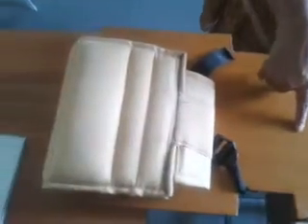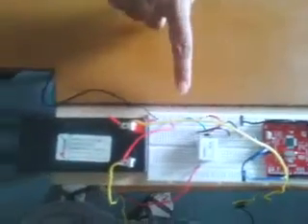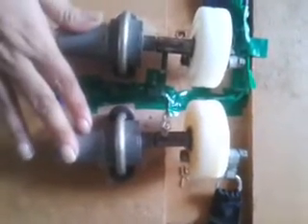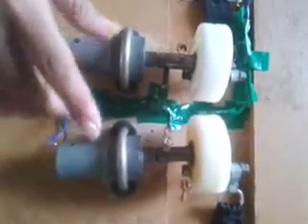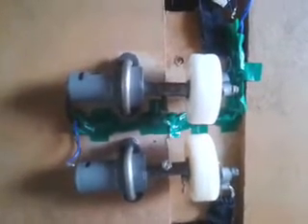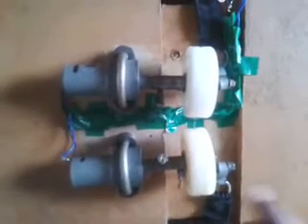The main components used in this project are the CPR board and the belt assembly, the microcontroller and its related circuitry, and the power sources. The entire compression of the device is achieved using this motor assembly. The motor assembly consists of the motor, the shaft, and the eccentric wheel. The motor assembly has been designed in accordance with the objective of keeping the device simple and modular.